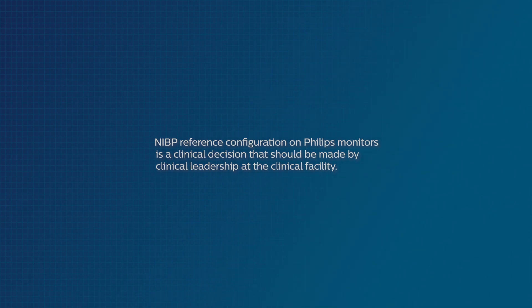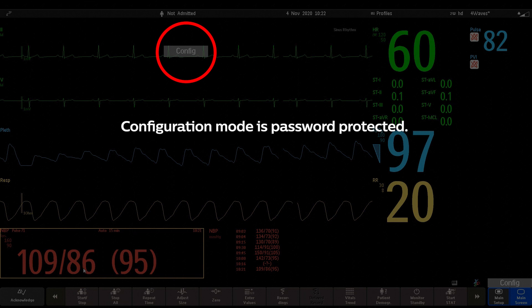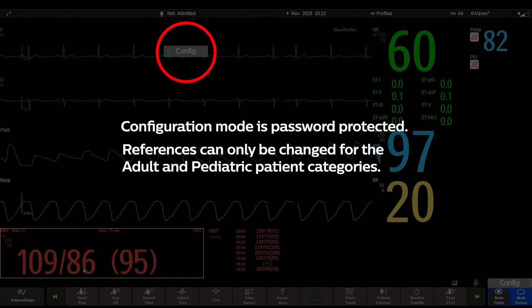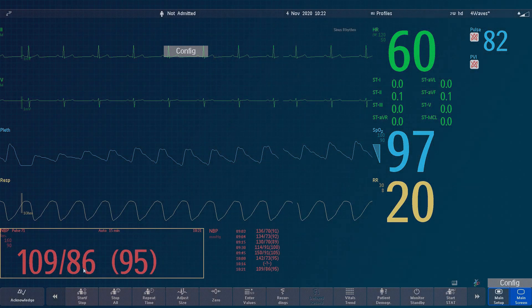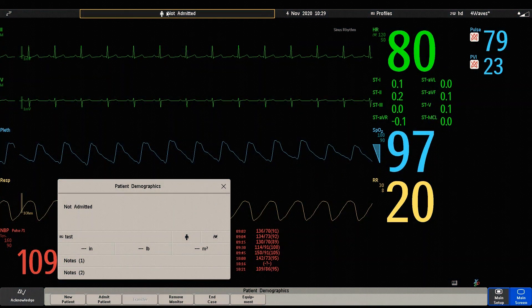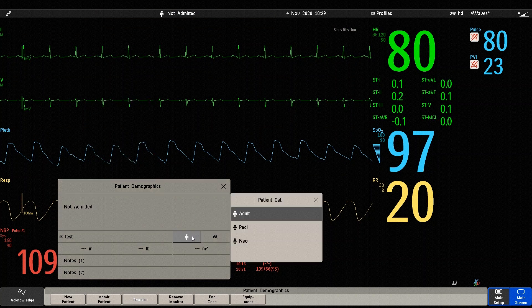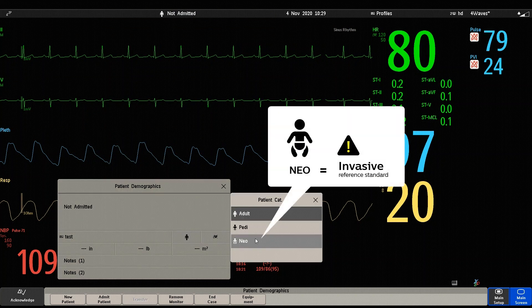The NIBP reference setting can only be changed in configuration mode. To comply with safety standards, the reference cannot be changed for the neonatal category and is always set to invasive.